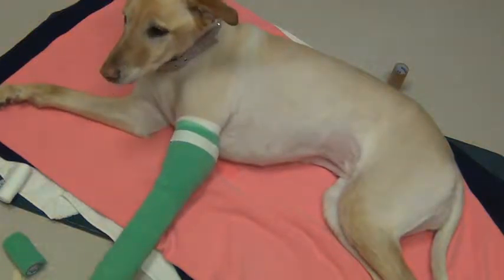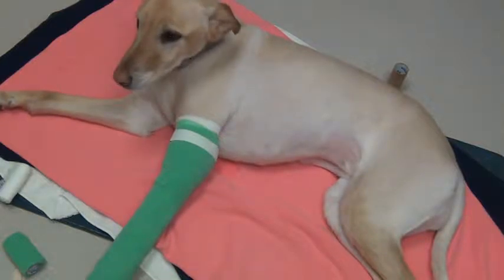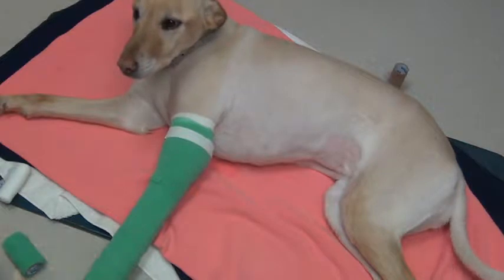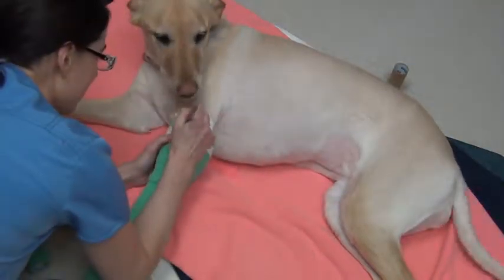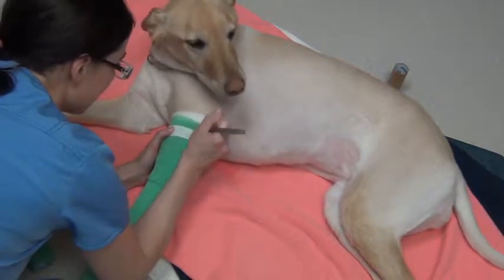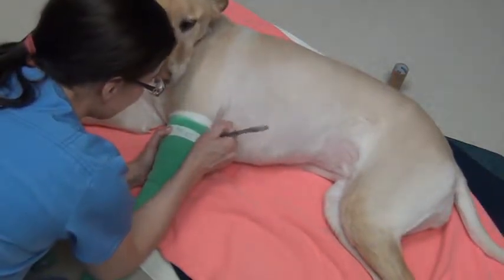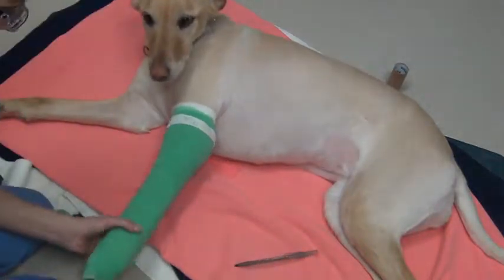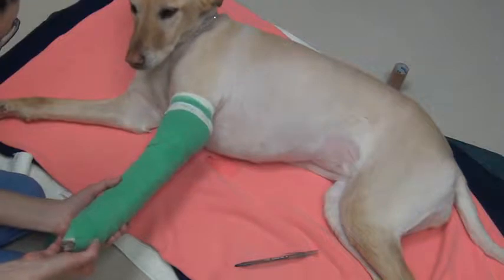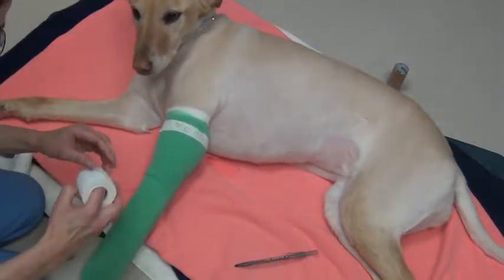Miss Daisy's date. So I'm going to write the date that it was applied, which is 3/25. And then I'm going to write my initials. And we're going to put one more piece of tape on the bottom just to shield the portion where the metal splint is closest to the top, since we don't have a lot of padding there.